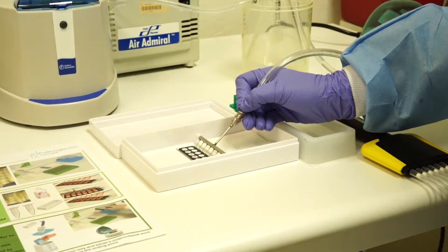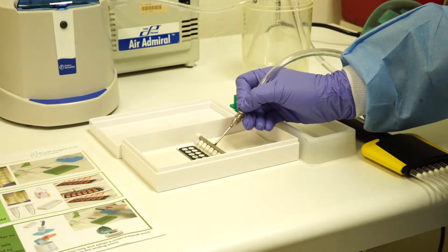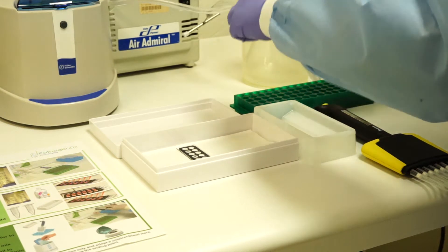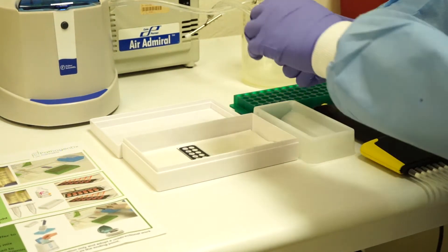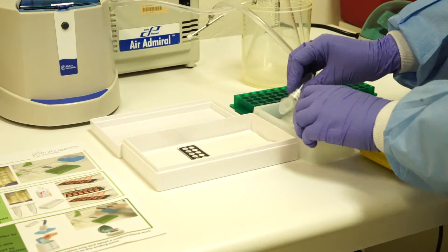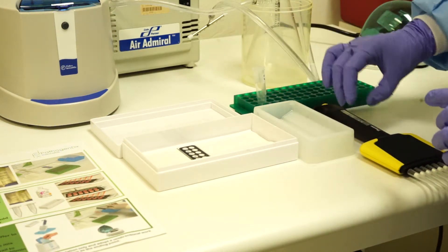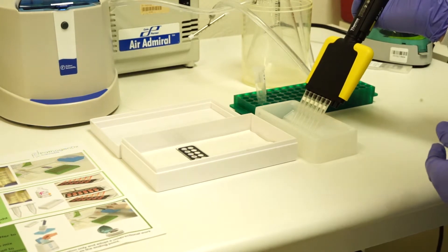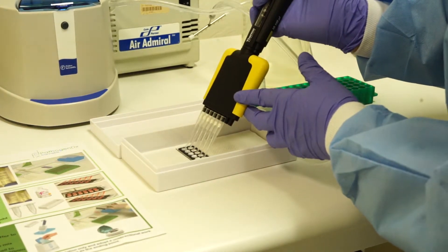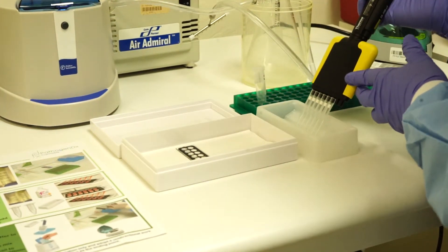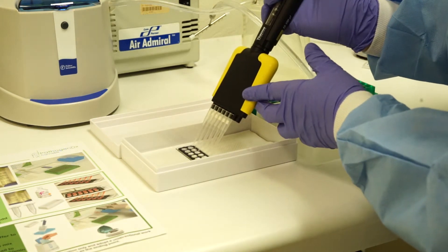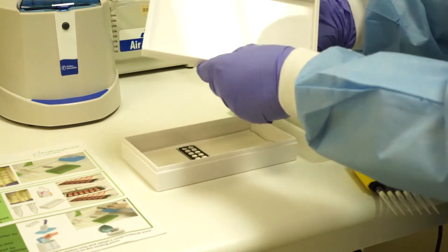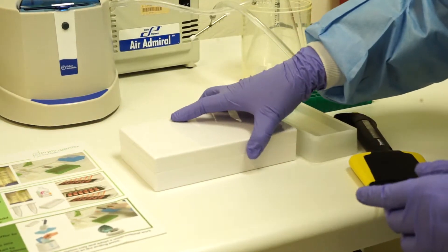Once the 30 minute hybridization is complete, aspirate the hybridization cocktail from the slide. Take your vortexed hybridization wash buffer and pour into a clean pipette basin. Set your pipetter to 75 microliters and carefully dispense onto each well. Once you have dispensed, aspirate and repeat the dispense for a total of two dispenses. This will stay in the hybridization chamber for 10 minutes.